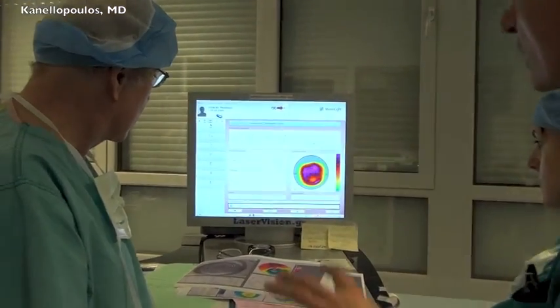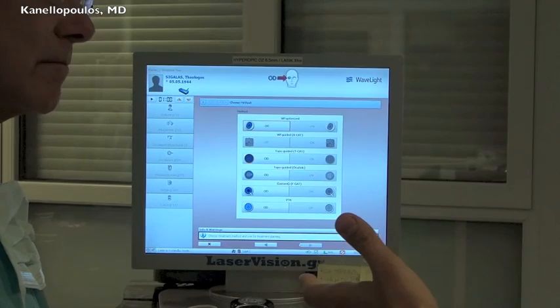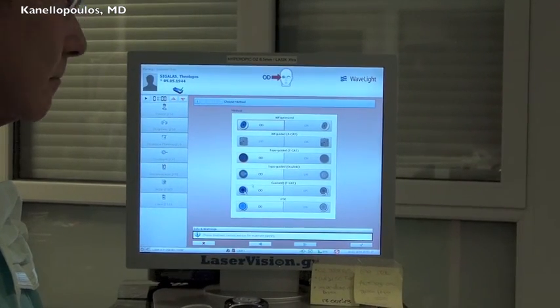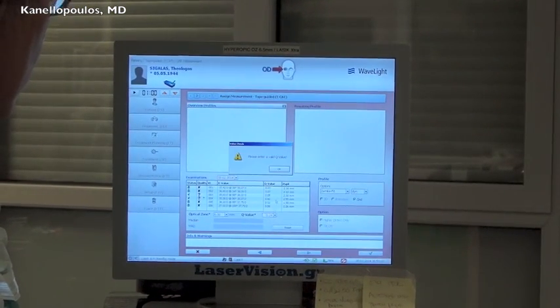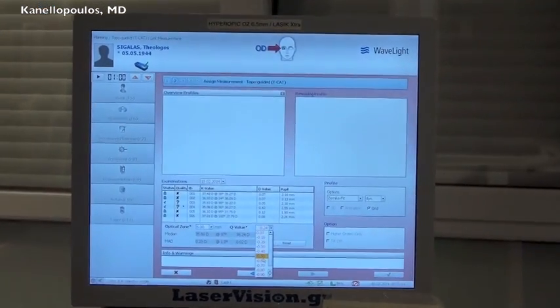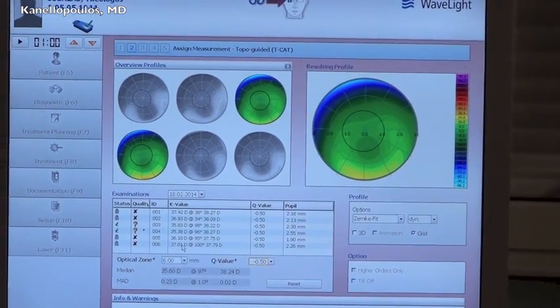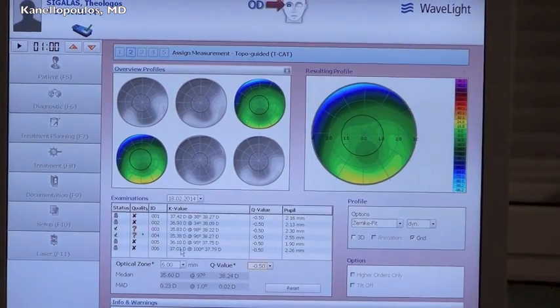Because this is a very interesting case where the two will not compare, and because of the opacity, we're probably going to choose the placido test image instead of the Pentacam. So I think just by luck today, we covered pretty much the whole spectrum of topographies. Where do we expect more of the placido disc image, where more of the Pentacam?